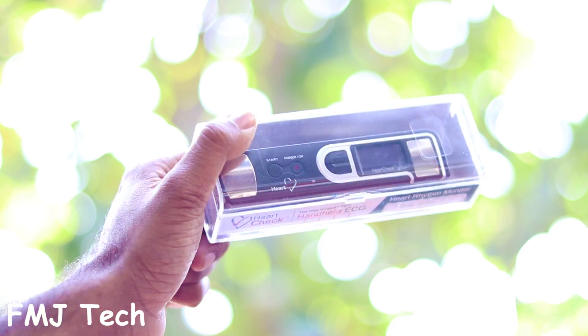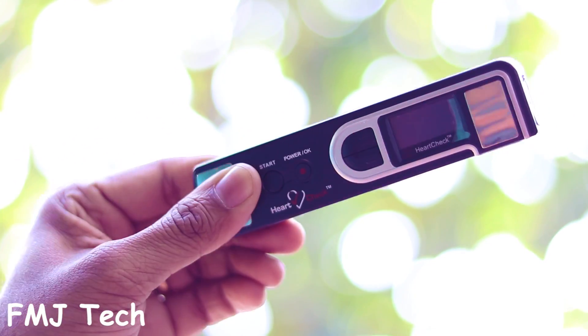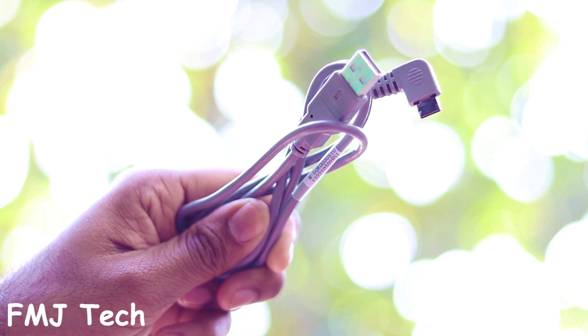So let's unbox and see what we get inside. Inside the package we get the handheld ECG pen and a data transfer cable. Its small, compact form factor makes it easy to carry around like a pen.